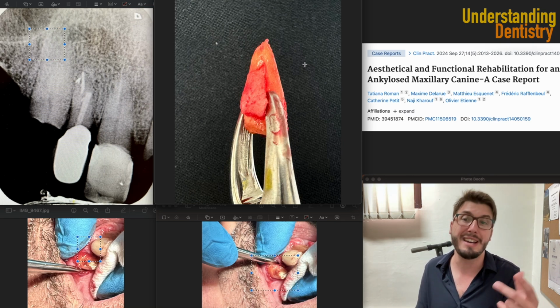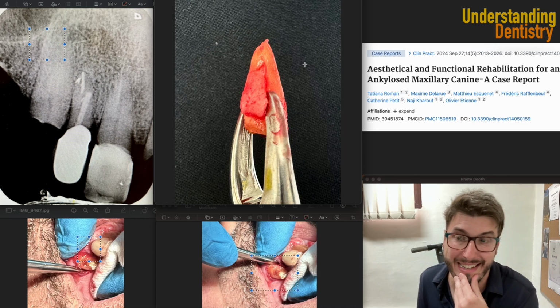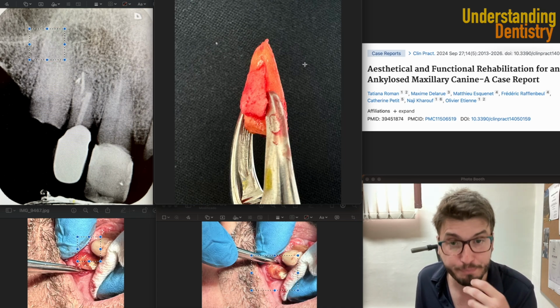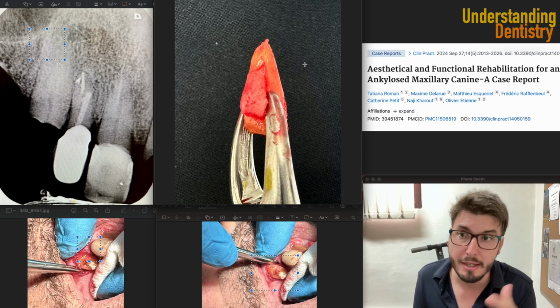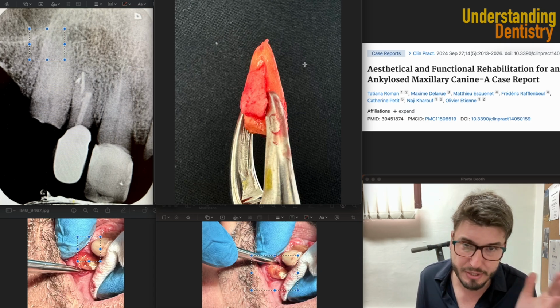If you had a CBCT, then you would be able to assess this in 3D with slightly more detail. So again, take-home message, we should diagnose first from the radiographs, if possible. If you have a CBCT, even better, but it depends on the indication for every single case.